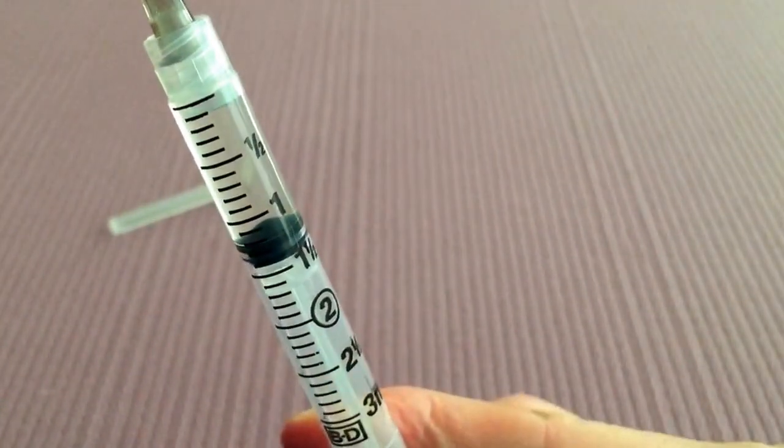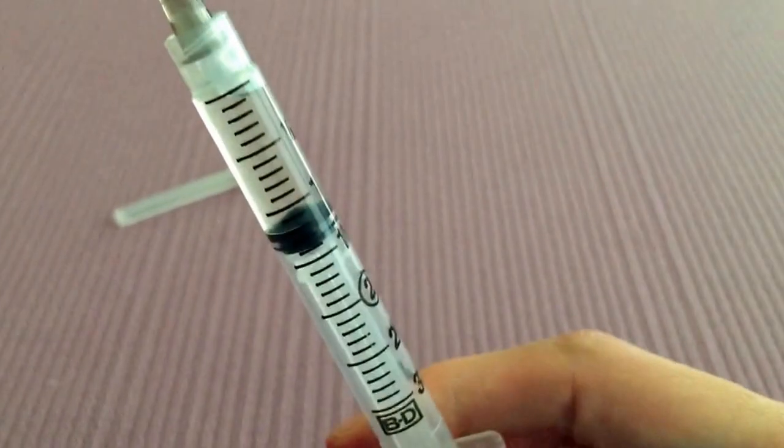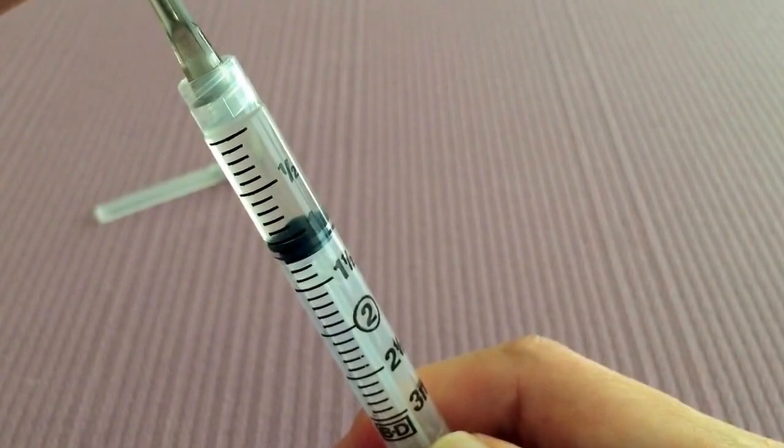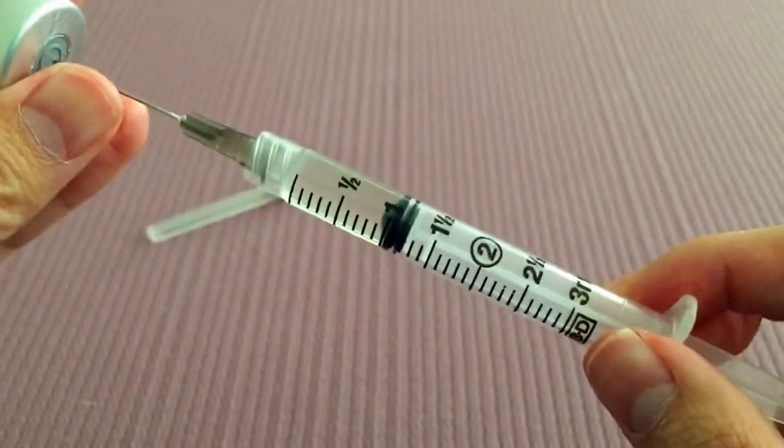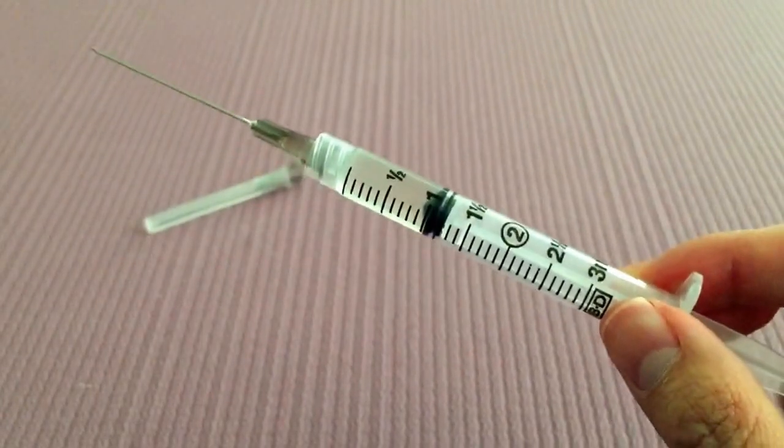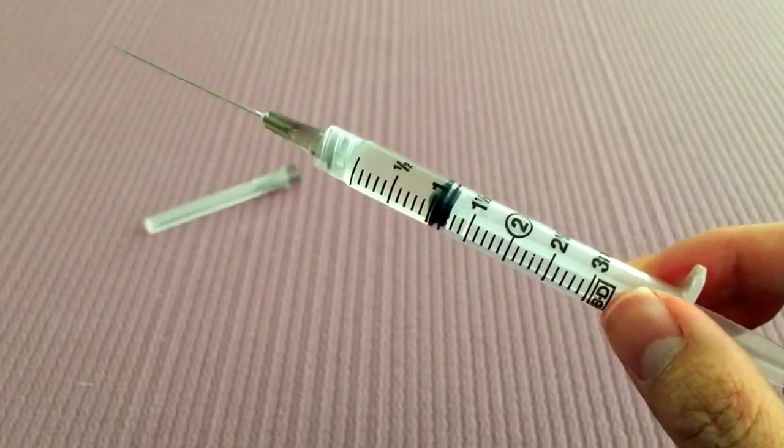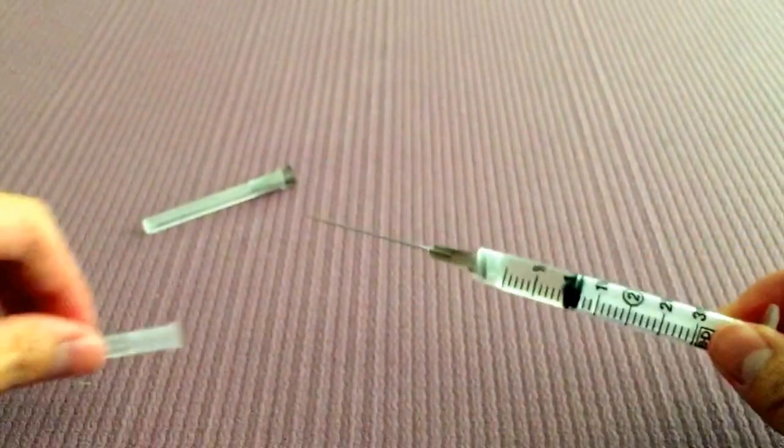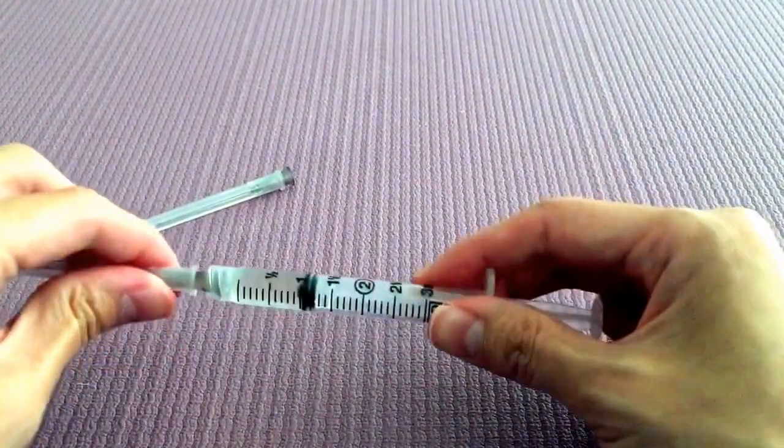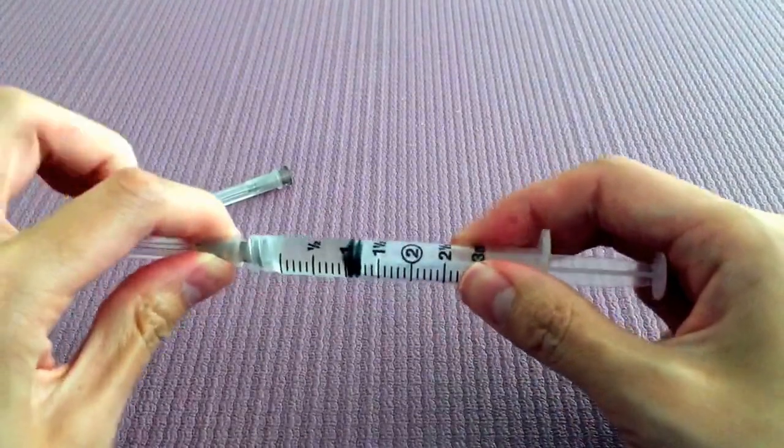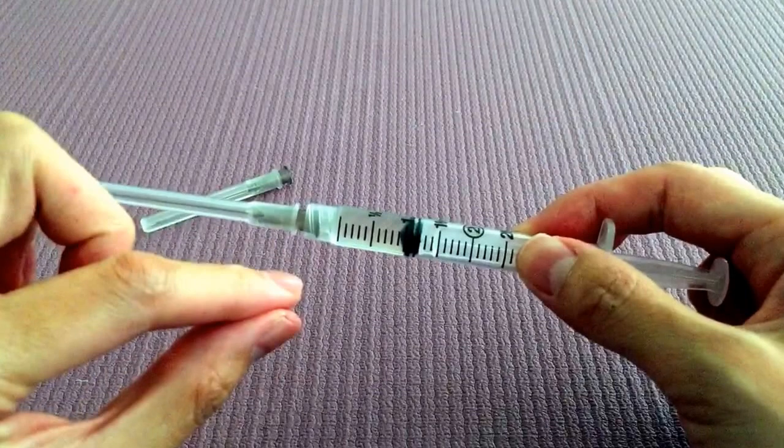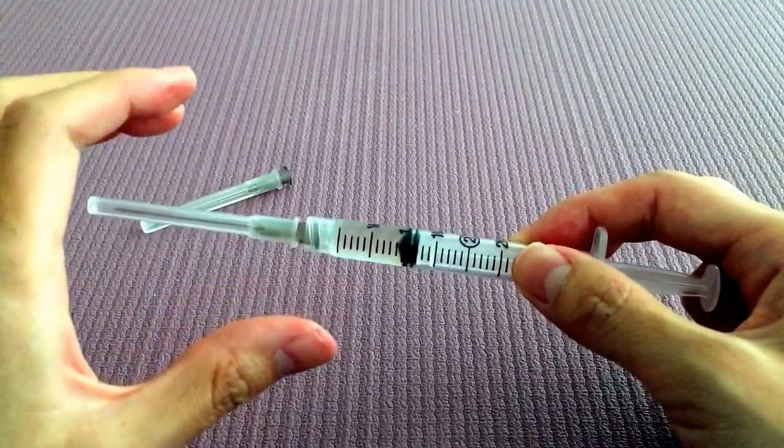So I think we're good. I've even pulled past the 1 mark just a little bit. I'm going to just inject that back. And we are ready to do our intramuscular injection. So what you want to do next is cap this. Be very careful. And then be careful when you take off this needle to swap the heads. A little bit of oil might come out. So just do it quickly.